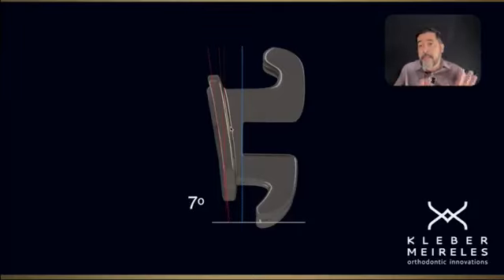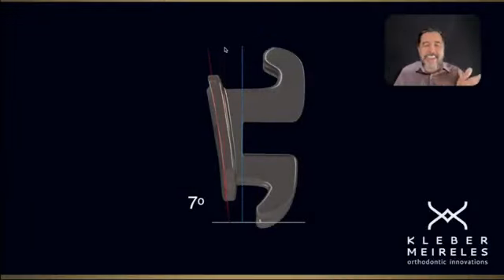But when the inclination is in the base, it is something like that. We plan to position this slot parallel to the horizontal reference, like here. So we have this slot parallel to the horizontal line, and the base is inclined.